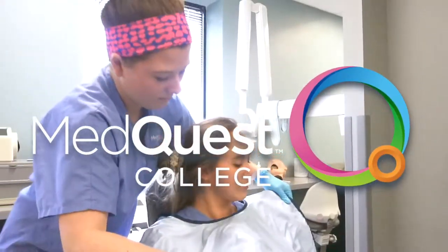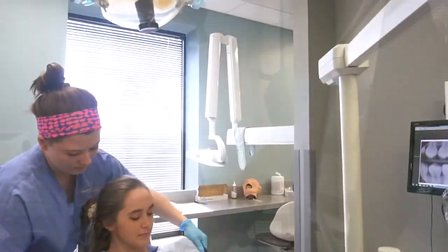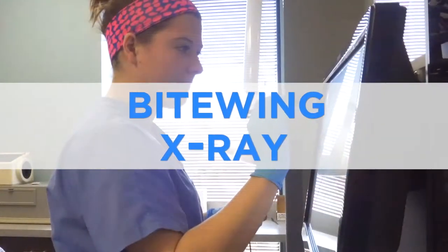Hi, my name is Kara Hall, and I'm a dental assistant at MedQuest College. Today I'm going to show you how to do a Red Wren Bite Wing X-ray.